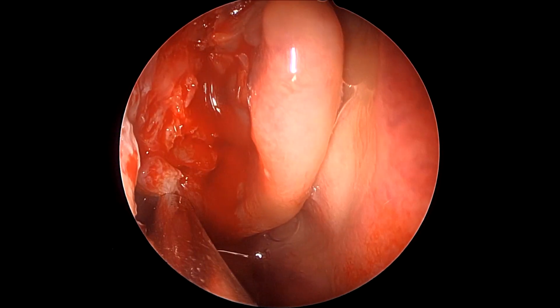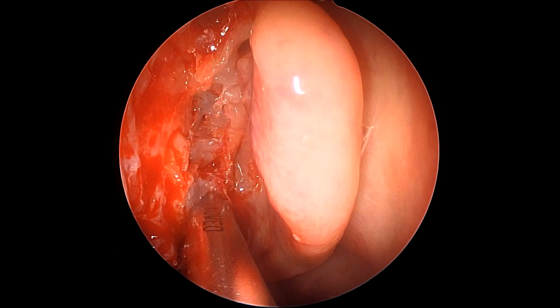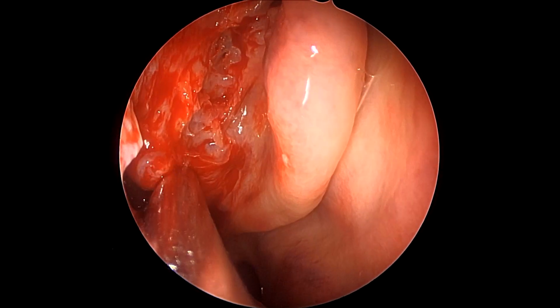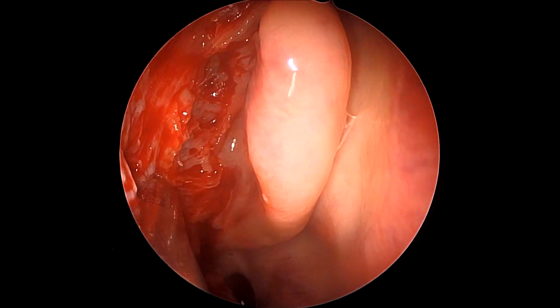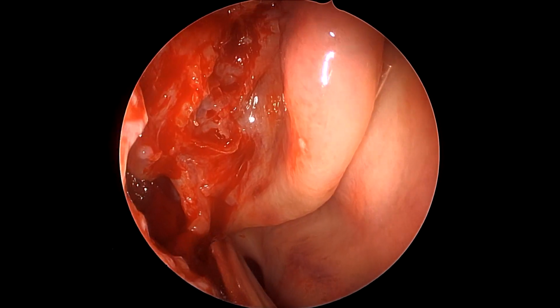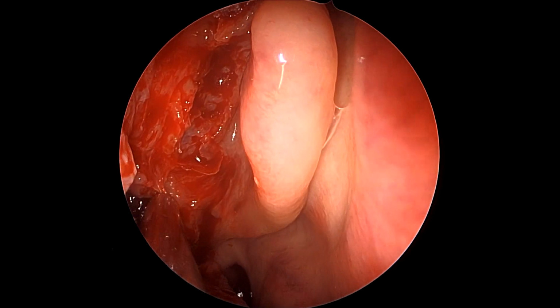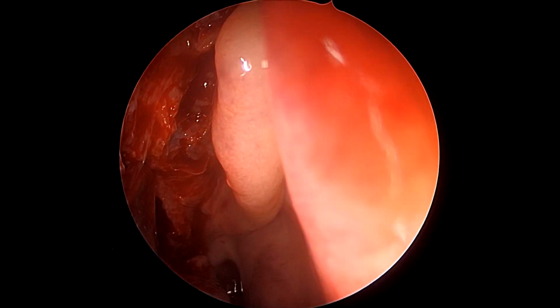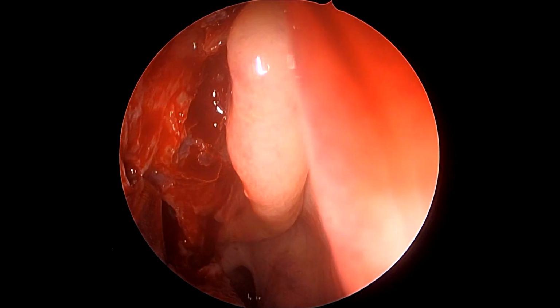It must always be borne in mind that the microdebrider blade must always be in vision when we are using it inside the entire sinus surgical work. Now, as we see, a generous antrostomy is being created by removing the excess wall on the superior wall of the antrum, the posterior and the inferior wall of the antrum, flush with the inferior turbinate. One must be careful not to make the posterior wall flush right to the posterior wall of the maxilla, because that can traumatize the sphenopalatine vessels unnecessarily and produce brisk bleeding. It is not desirable nor required in a standard sinus surgery patient.